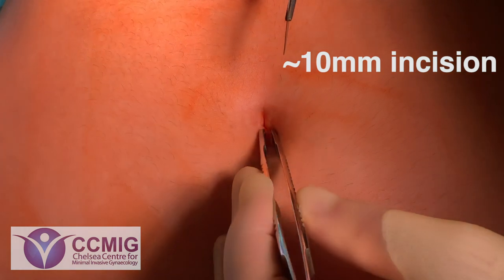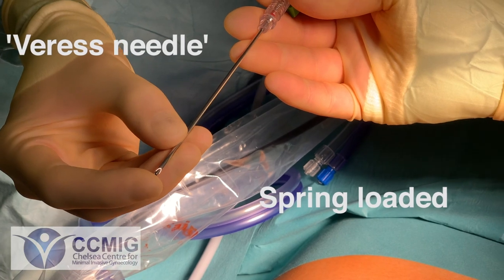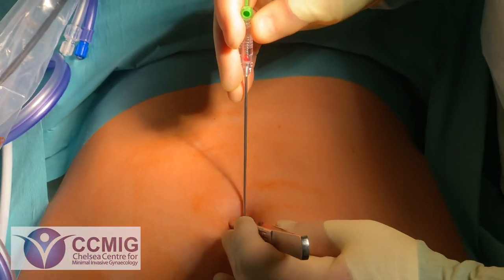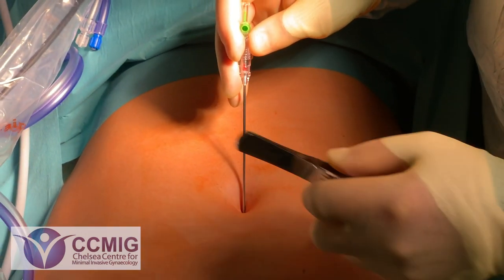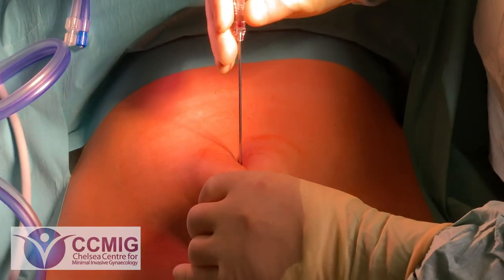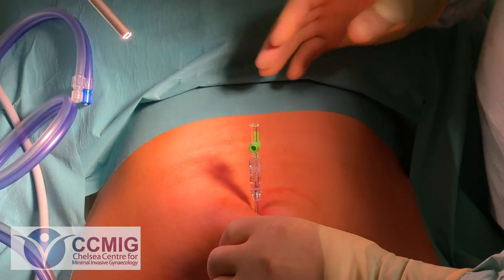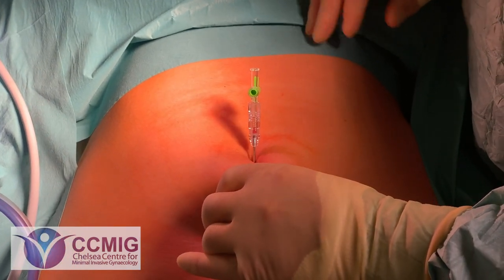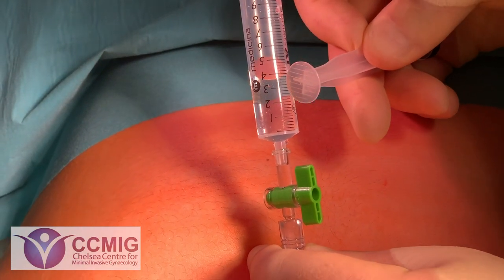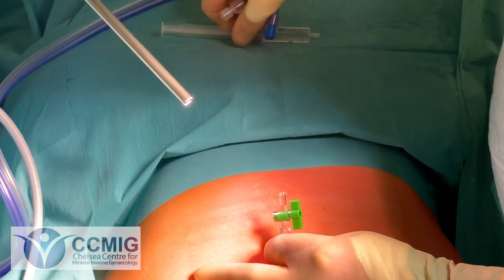There you can see the first incision with a scalpel which has just gone through the superficial layer, the skin. This instrument is called a Veress needle. You can see at the end it's a sharp needle with a little spring, such that when it's gone through the stiff layers of the abdomen into the opening we call the peritoneal cavity, the spring is then activated so it doesn't injure anything below — things like the bowel or major blood vessels. The Veress is inserted steadily through the layers of the abdomen until you can feel that spring release. We test we're in the correct cavity using saline — just salty water — which drops freely into the peritoneum; were the needle to be in any bowel or blood, that wouldn't happen so clearly.